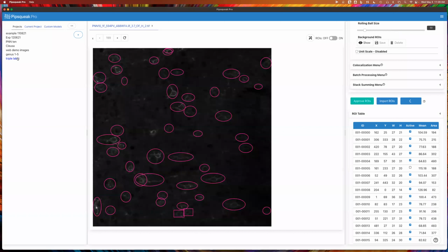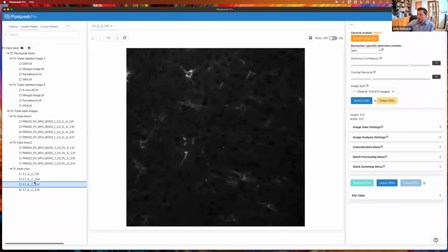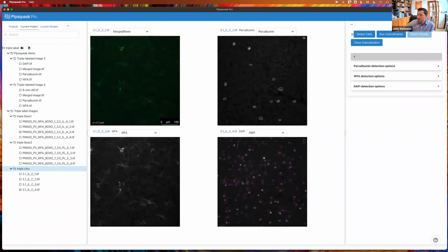John. So, yeah. There was a question in the chat asking about the existing biomarker detection models we have. Do you want to just show them the list and talk a little bit about the models real quick? That's a great question. Models. Let's move over to a multiplex analysis, and we can start to look at that.